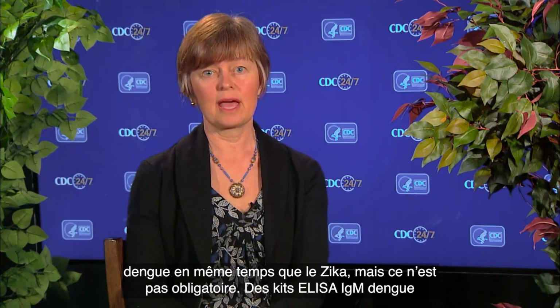Currently, there are no commercially available kits for laboratory testing of Zika virus infections. Because of the cross-reactivity seen among flaviviruses, it is preferable but not required that dengue should be tested for concurrently with Zika, and dengue IgM ELISA kits are commercially available from multiple sources.